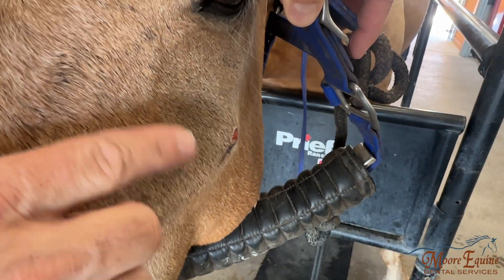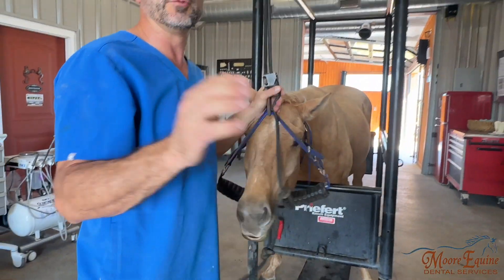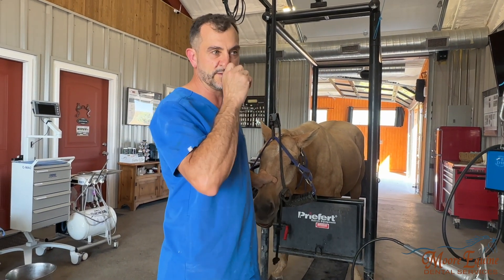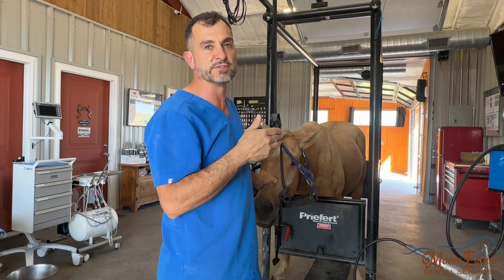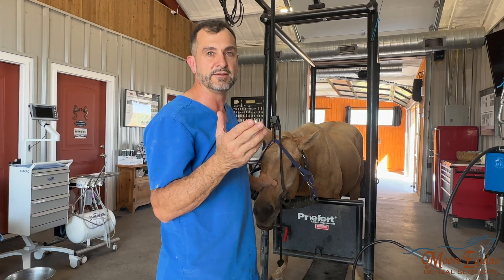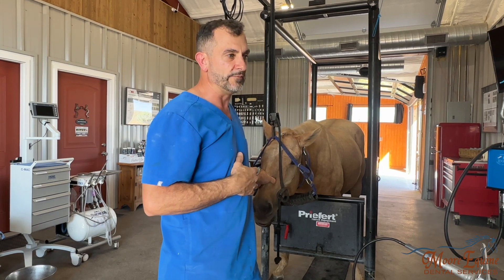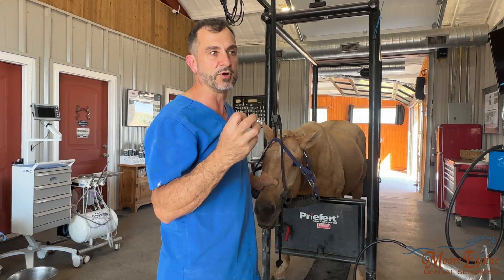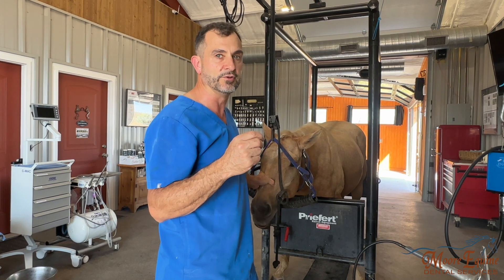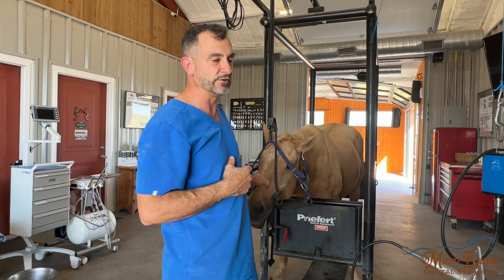Now we're going to show you in the mouth. The horse also has a history — when he was examined for this, it was found that he had a fractured 208 with a central fracture. That was attempted to be removed but part of the root stayed in, so we have a couple of root fragments to take out on the 208, and then he also has some other issues that we're going to talk about.